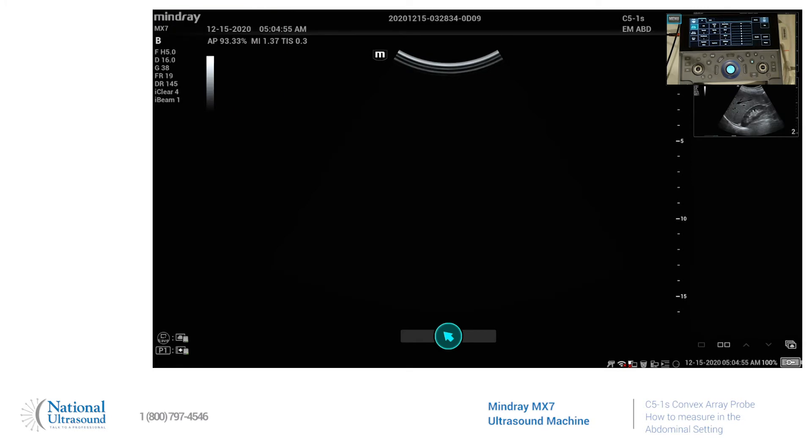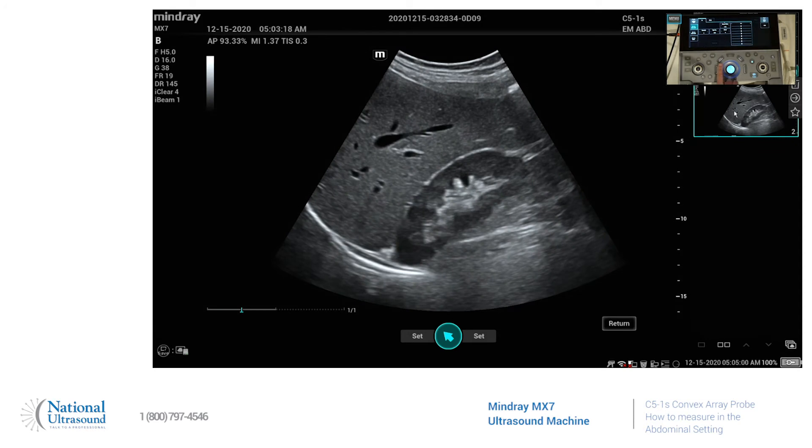So I've already taken an image. I'll pull one of them up, and the measure key is right here to the left of the trackball, and your calcs packages are going to be up here on the touch screen.